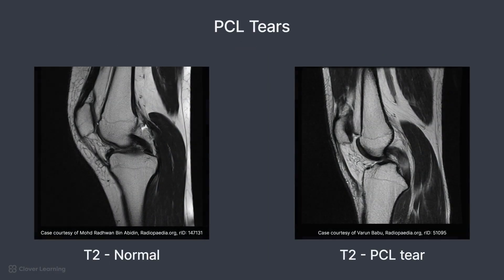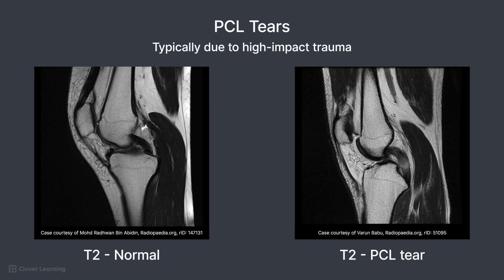Posterior cruciate ligament, or PCL tears, are less common, typically resulting from high-impact trauma like dashboard injuries in car accidents or hyperextension. A normal PCL appears as a low-signal curved structure in the intercondylar notch on sagittal images. Tears show high signal discontinuity or thickening on T2-weighted images. On the first image, you can see the intact PCL with uniform low signal. On the second image, you can see a partial tear with increased signal and partial disruption of the ligament fibers.